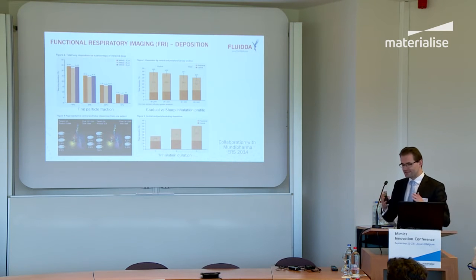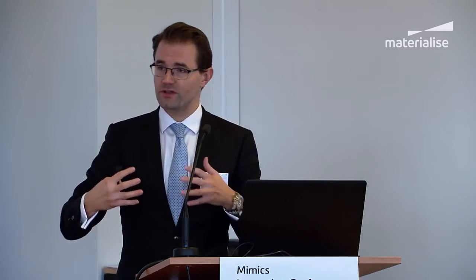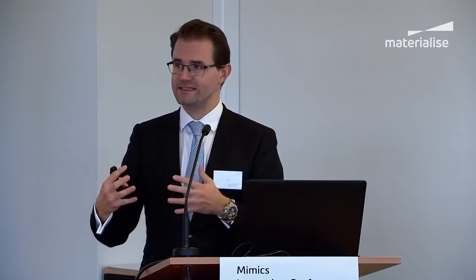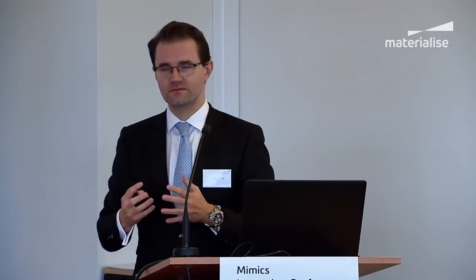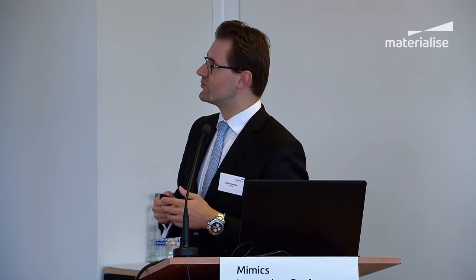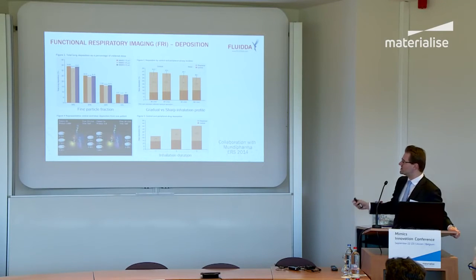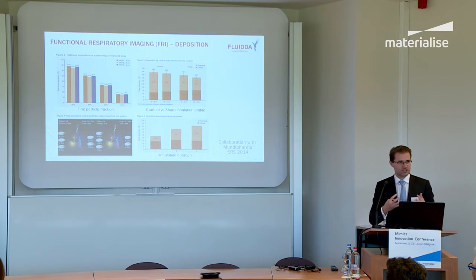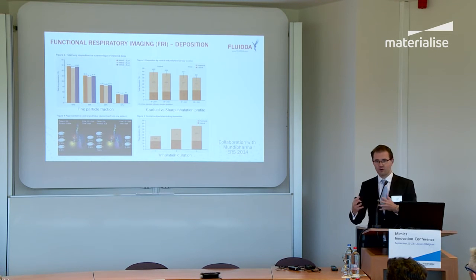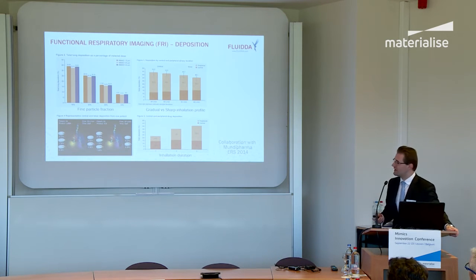The advantage of doing that is that based on the simulations, you can test different scenarios. So if you're a drug developer and you want to develop a formulation with a device, we can actually help you to understand what drives specific deposition. Is it the fine particle fraction in your formulation? Is it the way the patient inhales, the gradual versus a sharp inhalation profile? Is it the duration of the inhalation? All these factors play a role, and often it's a question of what drives deposition most. So if I have limited resources, where do I have to spend my resources in order to get the results that we'd like to have?